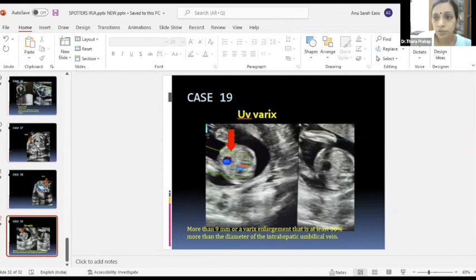And then Dr. Anu had shown us a case of percreta. I think the diagnosis is rather easy on MRI, but the challenge is finding the adherent placenta in the early stages on ultrasound. We also saw a case of fibroma thecoma complex with MRI T2 dark appearance. And I think the last case was on Mullerian anomaly, which can be asked as a classification of Mullerian anomaly. I think that is one of the theory questions as well. We also saw a good collection of obstetric cases. I think there are no questions in the chat box.